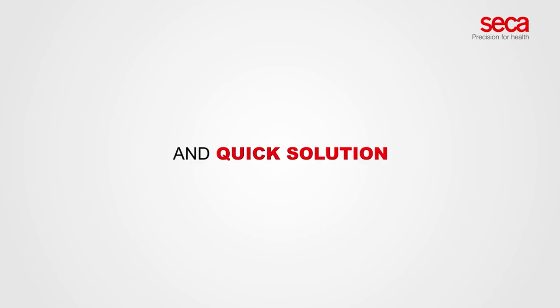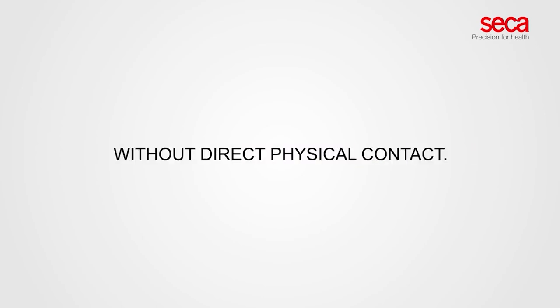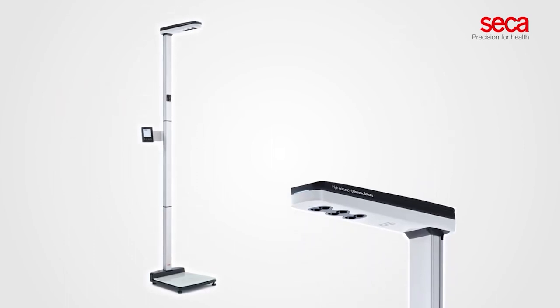A secure and quick solution to assess your weight, height, and BMI without direct physical contact. The seca 286 ultrasonic measuring station offers fully automatic assessment of weight, height, and BMI. Done within a few seconds, it is perfect for situations that require physical distancing.